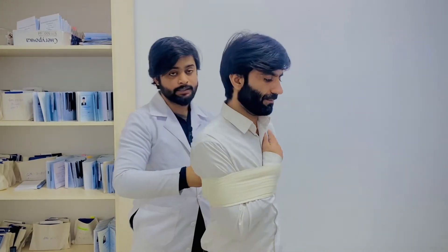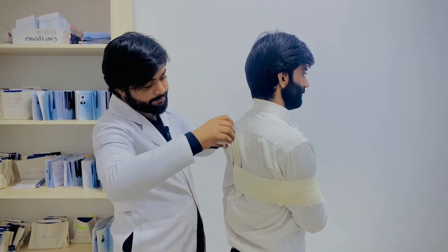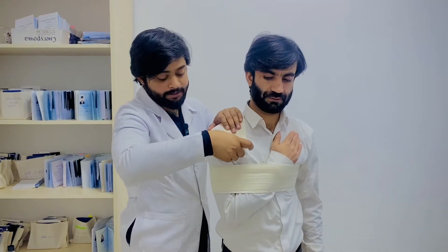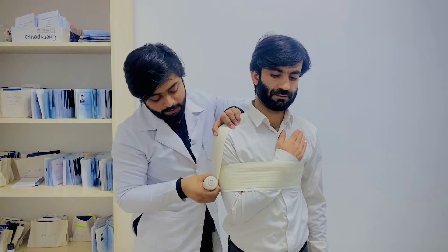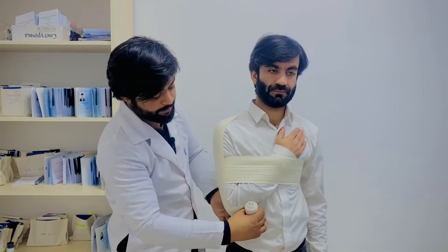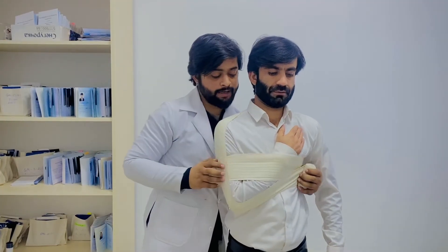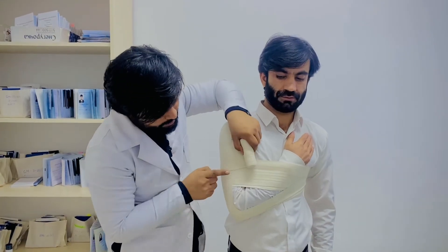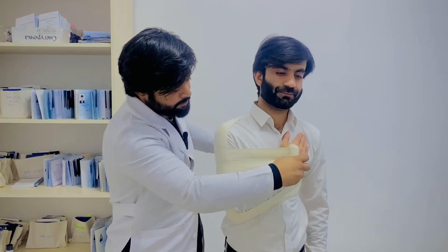After completing the two circulations, take a turn from the spine region and cover the supraclavicular region. Then go laterally to cover the elbow joint and make one circulation, but this circulation should be a little bit superior to the previous two circulations.